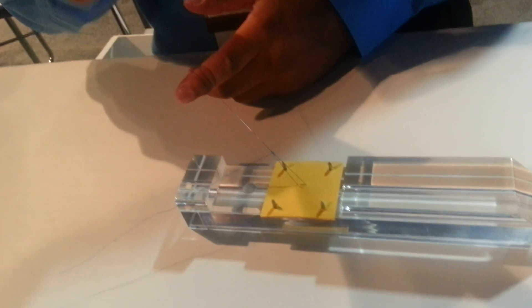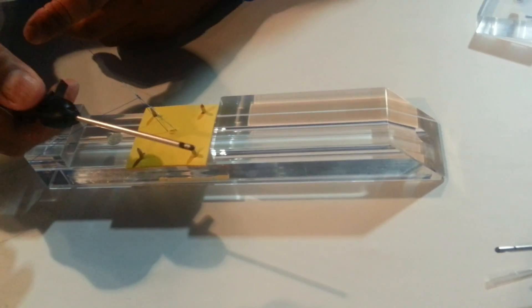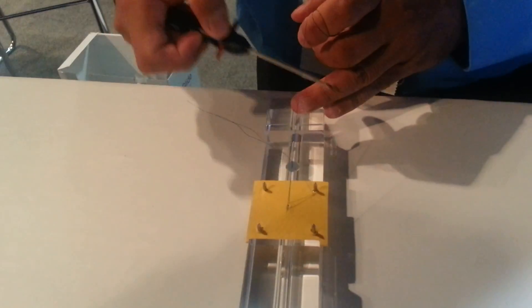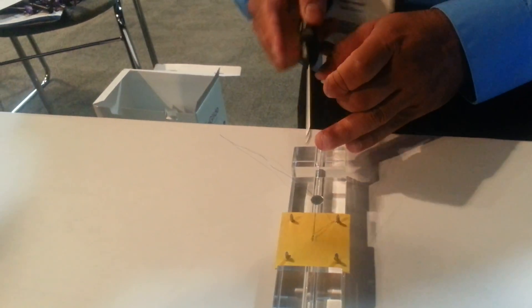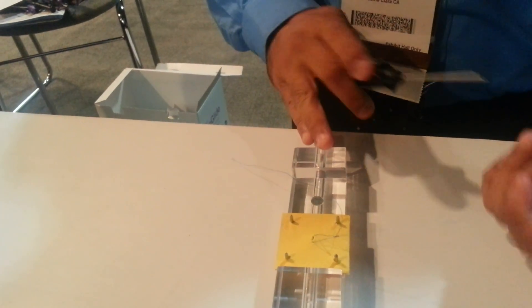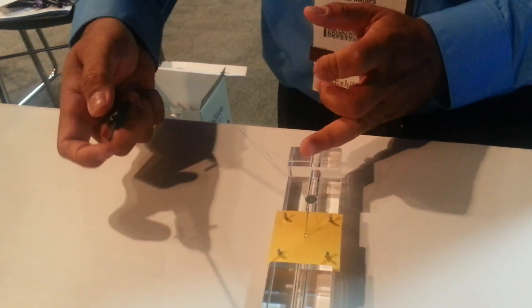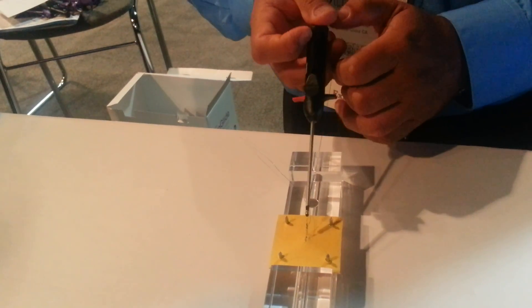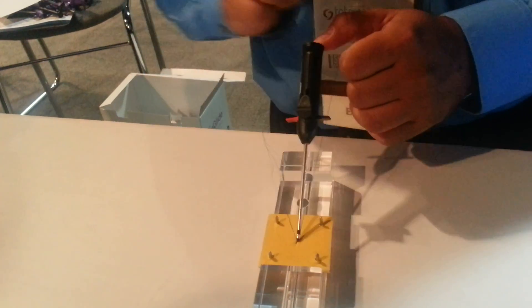I'm going to take the suture trimmer. Avoid the red at all costs — up until the end. You're just going to open the channel here. I'm going to go underneath like a violin. See how I'm keeping — I am staying coaxial. Stay coaxial. So I'm going to open, and then all I'm doing in this particular case is pushing that knot down — that's it.